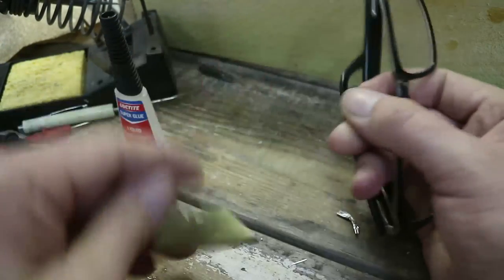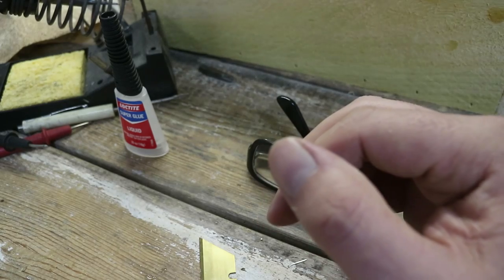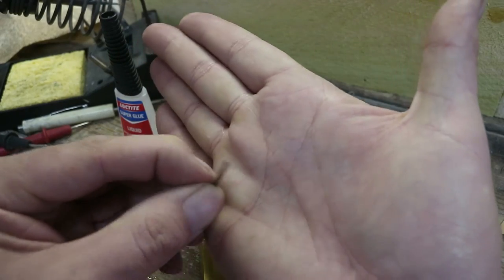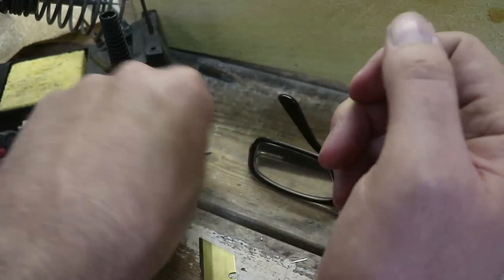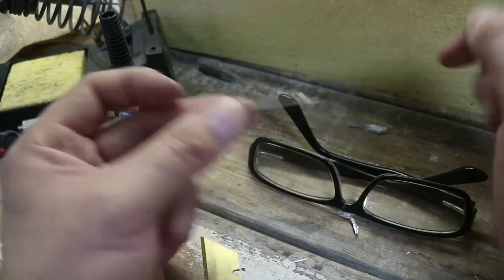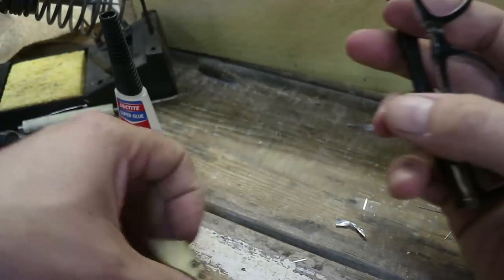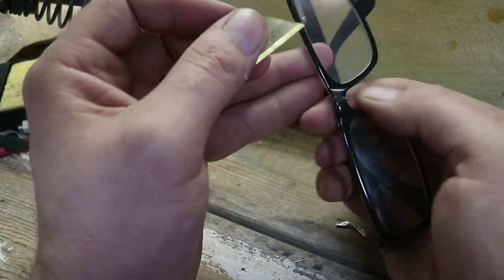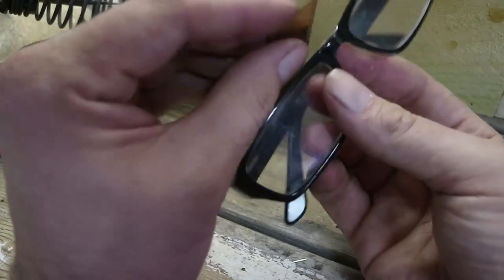And a trick that you can do in plastic, if you have to do something like this, is if you take a finish nail that has this sort of triangle tipped head, you can cut the head of this off, put this in a drill, and this will drill plastic, just friction. And so then I would cut that hole to the exact diameter of this and shove it in there, and that would hold it better than just the loose fitting epoxy staple method that I have going right now. But hopefully it's strong enough for now.